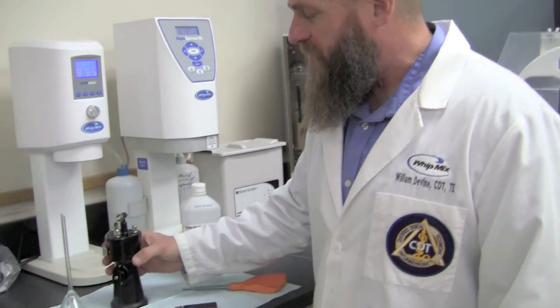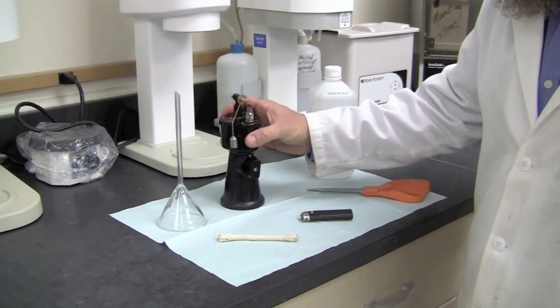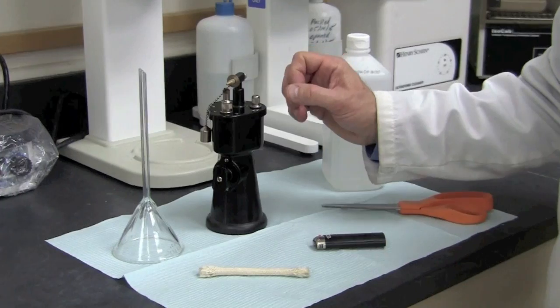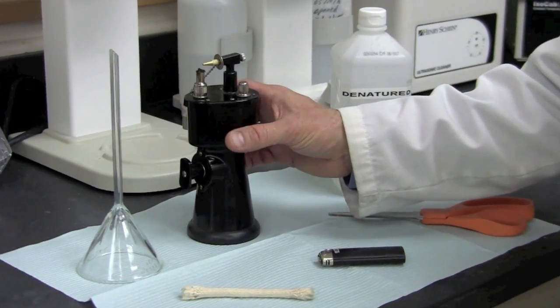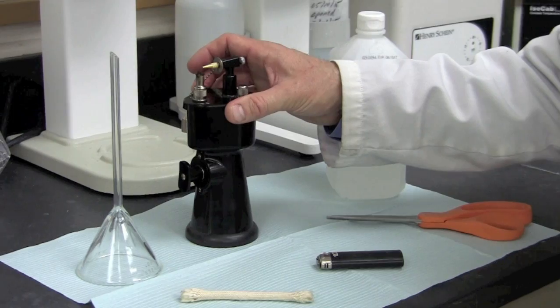The first thing we need to do with the alcohol torch is address any safety concerns — look for any visual cracks or any damage to the unit. Once we've inspected it, make sure that the unit is kept in the upright position for safety reasons. Spillage of alcohol can cause burns and damage to the lab.